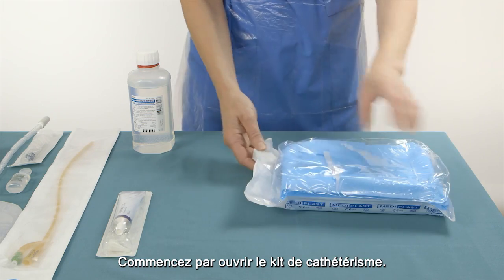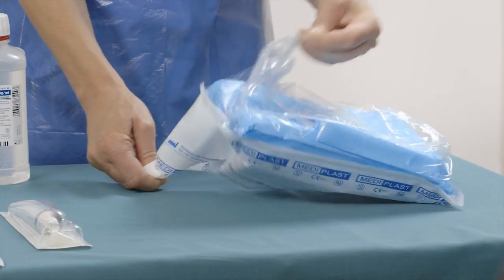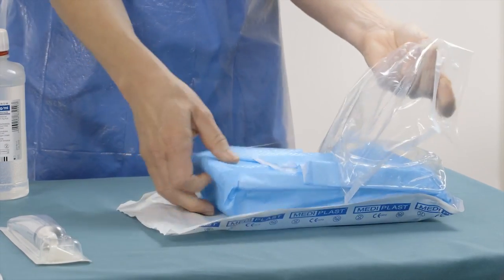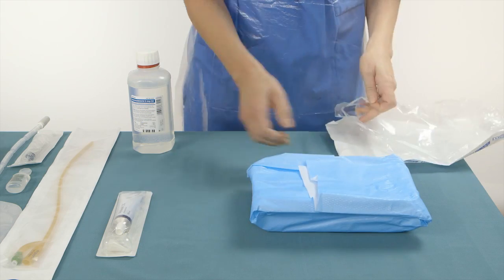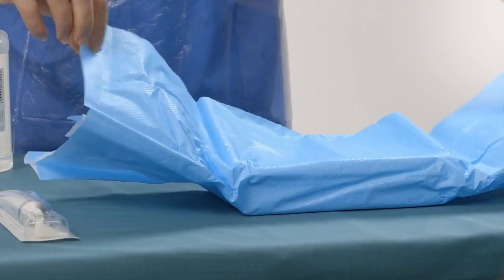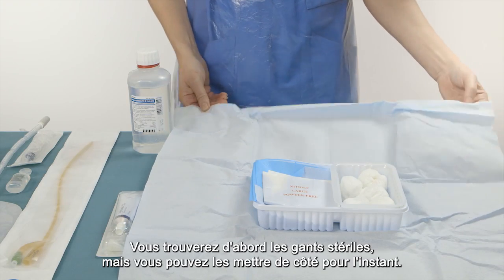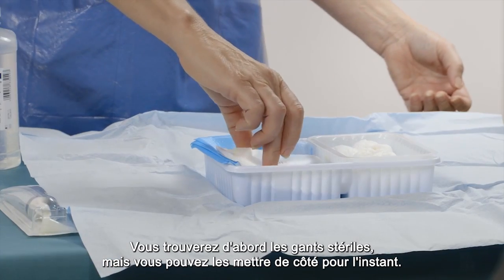Start by opening the catheterization kit. First you will find the sterile gloves, but you can put them aside for now.